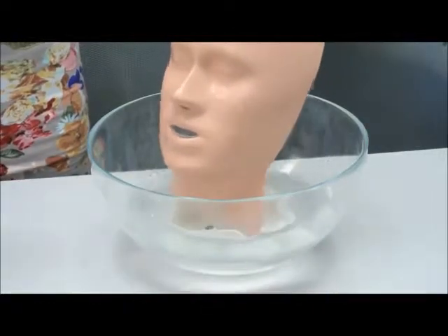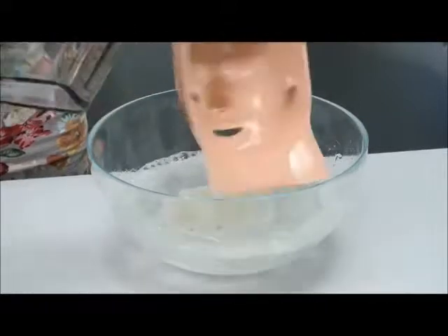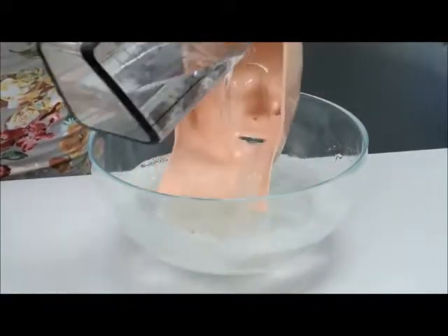The cleaning process should take approximately 30 minutes. Rinse all of the components with clean water and dry with a soft cloth.